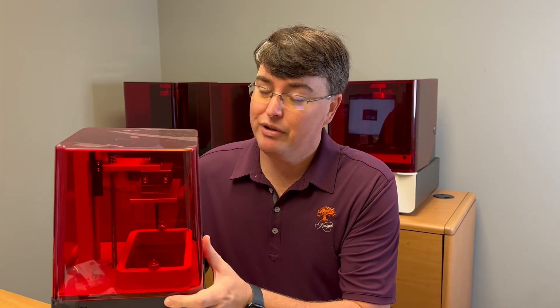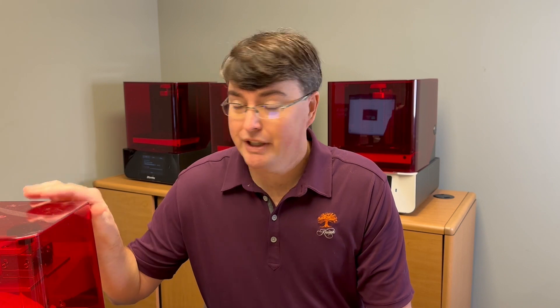For printers, you can go on Amazon and get a little fella like this right here — it looks almost like a toy. This particular model is a Phrozen Sonic Mini. There's also a slightly larger model, the Sonic 4K, from the company Phrozen — P-H-R-O-Z-E-N. The Sonic Mini is sub $500, and the larger size is sub $1,000, maybe closer to $500 as of the timing of this video.